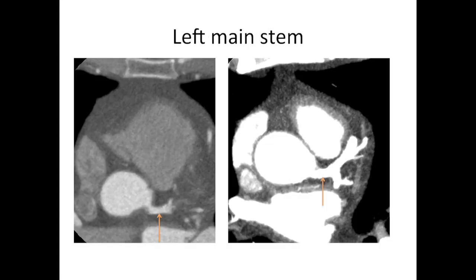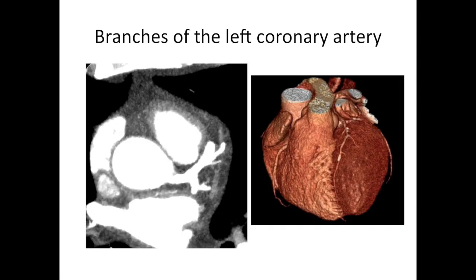Let's start with the left coronary artery. Here we're back to axial images. We've got the aorta here, and the left coronary artery comes out on the left side. The first part of the left coronary artery before any branches is called the left main stem. The left main stem then branches — the first branch is called the left anterior descending artery, which goes down over the front of the heart. Going backwards is the left circumflex artery.